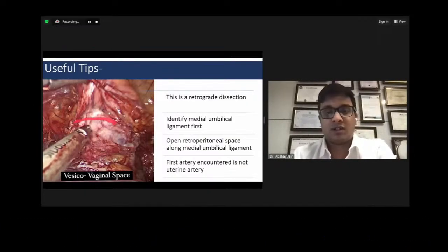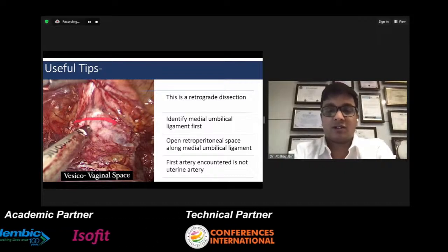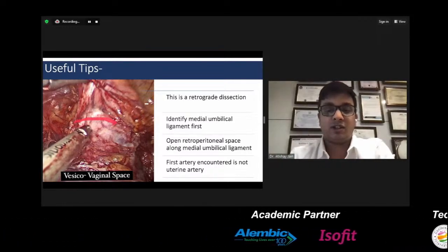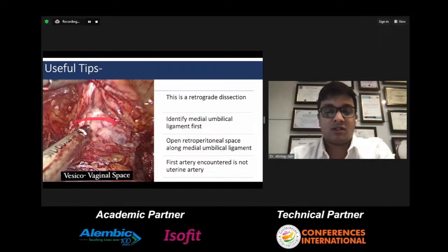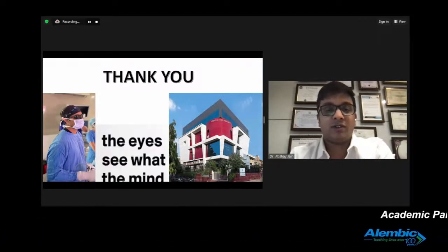So useful tips for the anterior approach: it is a retrograde dissection. You identify the medial umbilical ligament first, and then keep going down. And first, the artery encountered is not the uterine artery.